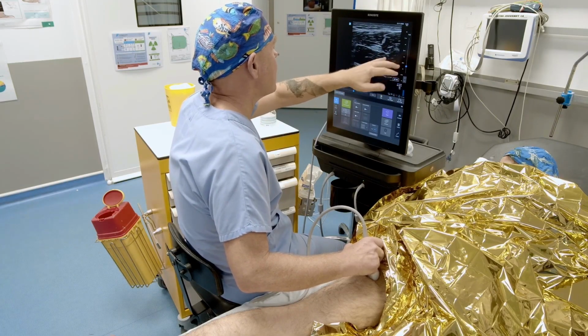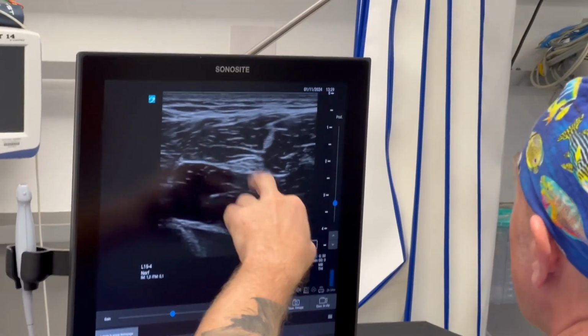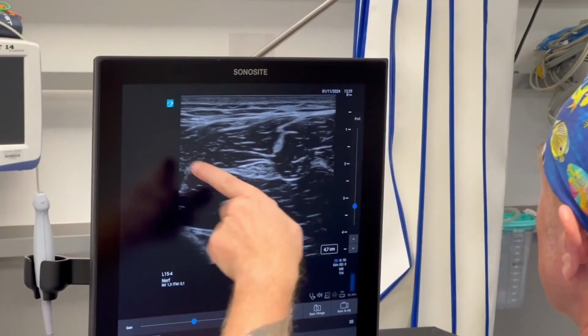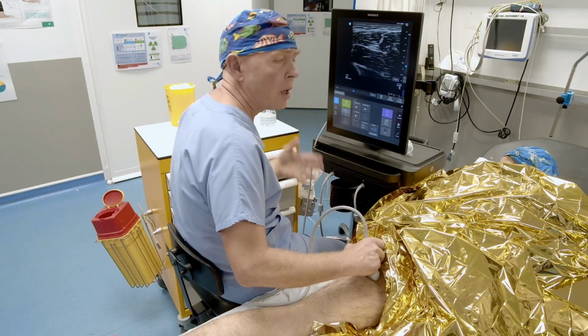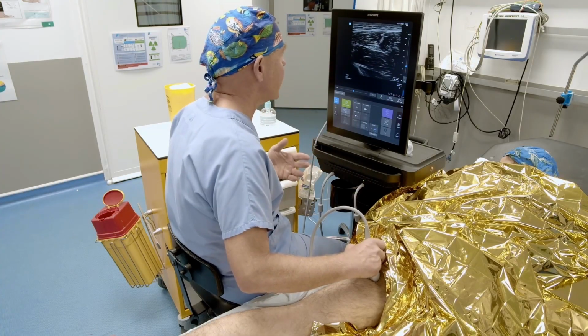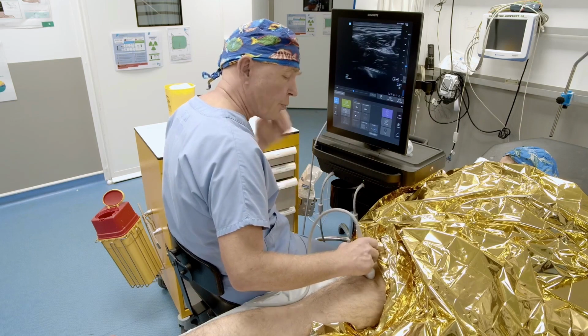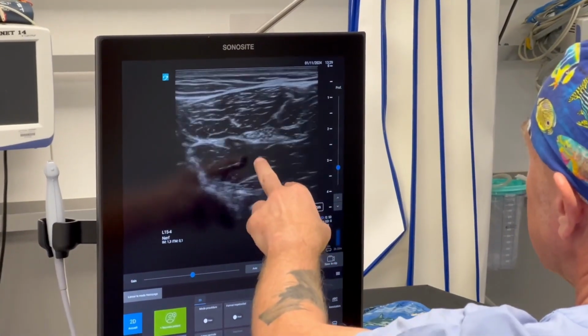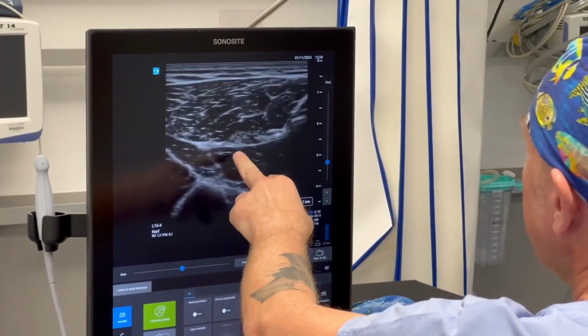Well, here, Sam is particularly slim and thin, but generally it's about 4 centimeters deep. So we have the characteristic image of the Sono-Anatomy element from step number 2. So just like we did with the nerves in the forearm, we can also very well do a workshop on this. And as you can see, we're following the nerve, right?